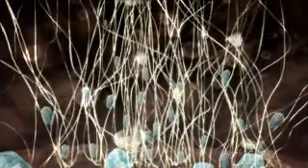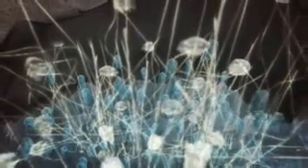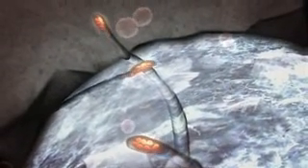If sufficient woven bone is produced, the grafted area and everything in it will be bound firmly in place, preventing movement. In a stable environment, osteoclasts, shown here by the multinucleated red cells, pass along the material surface, resorbing the newly formed woven bone. This is the commencement of bone remodeling. The osteoclasts are closely followed by a front of osteoblasts, which begin to build new, more functional bone.